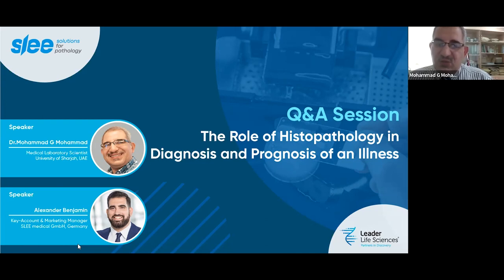Now, when you come to personalized medicine or diagnosis in histopathology, nowadays we have microscopes equipped with laser scissors, where you can target certain areas in the section and excise with the laser a few cells, maybe a single cell, that you feel is related to the pathology. These can go into single cell sequencing, like DNA sequencing, and be checked for mutations. This is what we have so far for personalized medicine. It's just at the level of the cell; even in paraffin embedded sections, we can target these single abnormal cells, excise them, and process them to find out what molecular events went wrong.